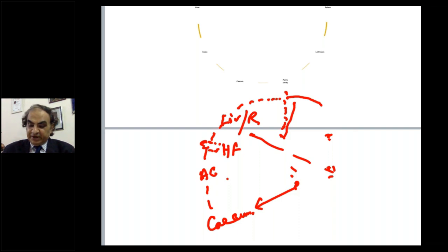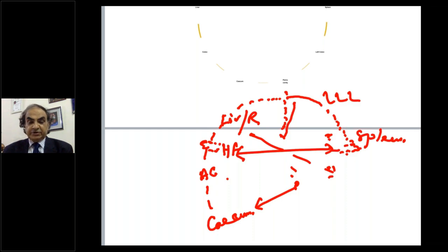You'll see the splenic flexure now in between, just exactly here. Now, if you don't do reverse Trendelenburg, you won't see the colon properly. The transverse colon certainly will get lost. So we'll see the entire colon. Now, and then the descending colon, sigmoid colon.